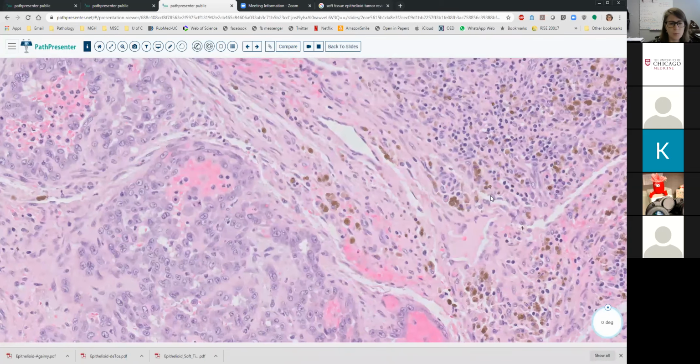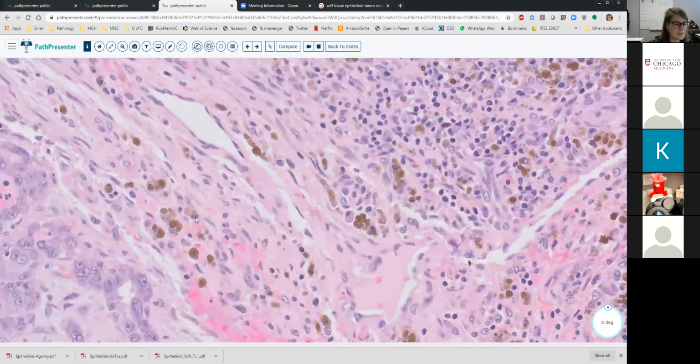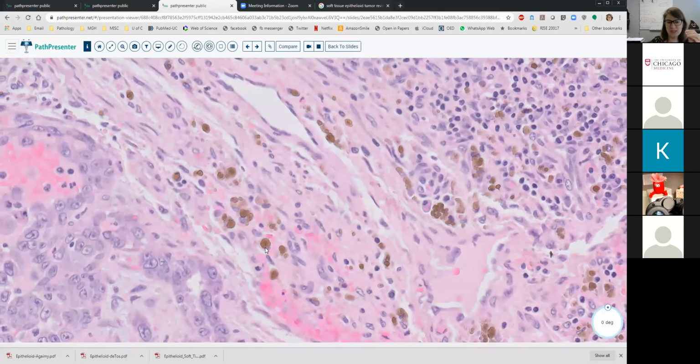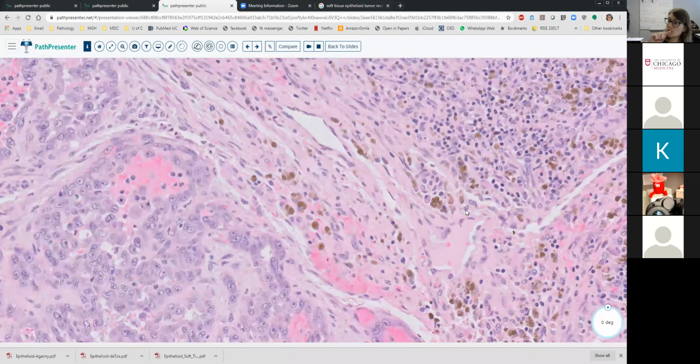Yeah. So what pigment? Or is it hemosiderin? It's very globby and of varying size and brown, right? Melanin should be more fine and really dark, almost black, very dark brown. So yes, this is hemosiderin, which still could help you, just in a different way.